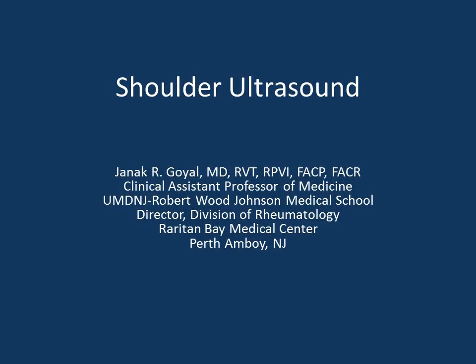Depending upon examinal space and individual preferences, there are multiple ways to position a patient for shoulder examination. Patient seated on a revolving stool provides an easy access to all parts of the shoulder for sonographic examination.